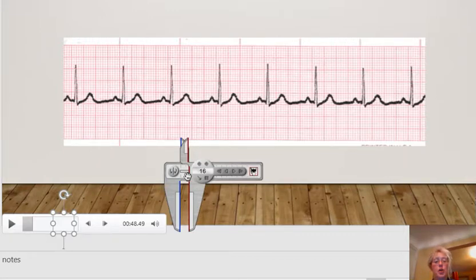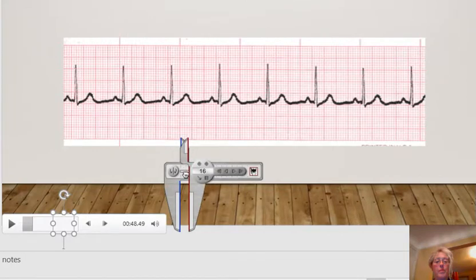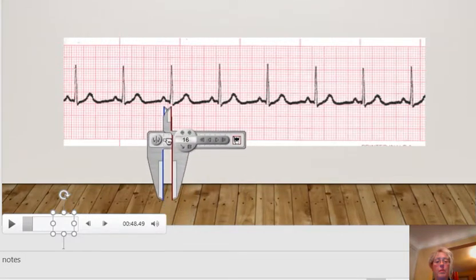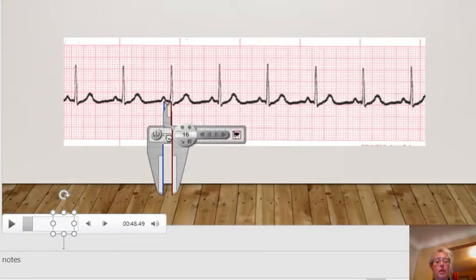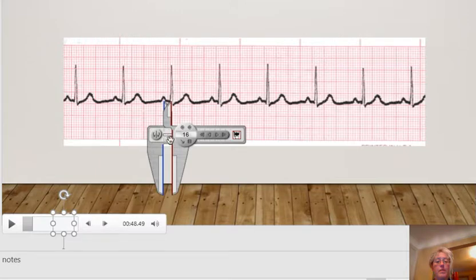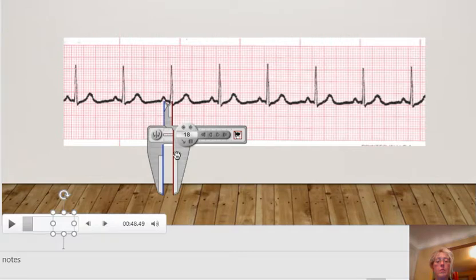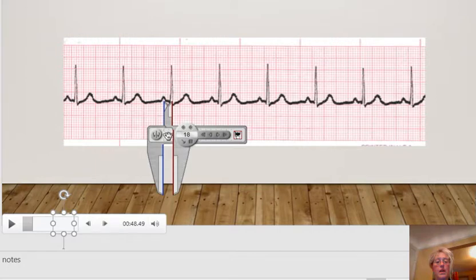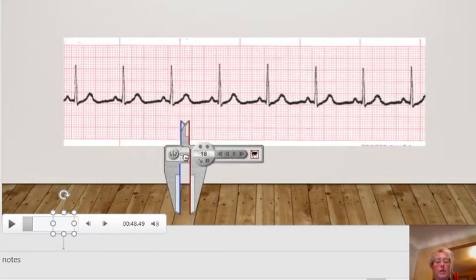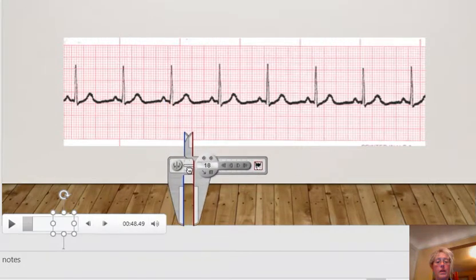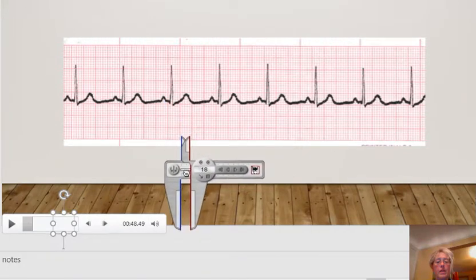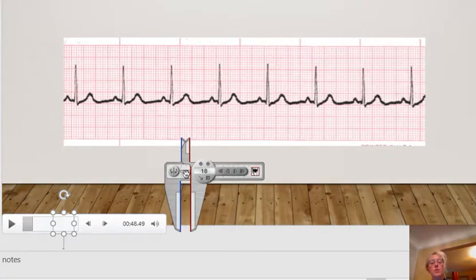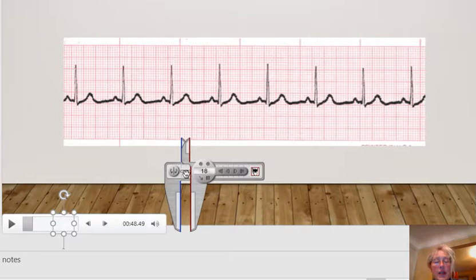Let's measure our PR interval, shall we? So our PR interval, we're going to go peak to peak, right? So we're going to open our calipers a little bit. And we said PR was between what? 0.12 to 0.20. Let's take our calipers, line them up on another vertical line. And we've got about four little boxes, which would put us at 0.16 seconds.